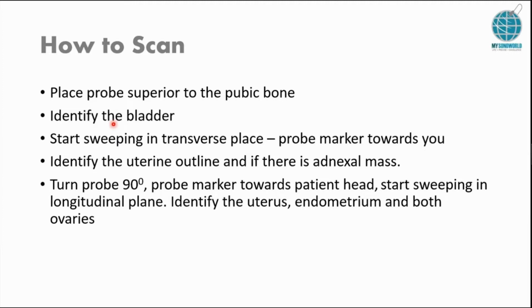Again, remember, if you can't see the bladder, it will be very hard for you to actually identify the uterus, let alone the ovaries, okay? Make sure you can see the bladder. Most of the time, people don't see it because they're scanning too high, where you're scanning the bowel. So slide your probe down until you see the bladder and then start sweeping in transverse plane.